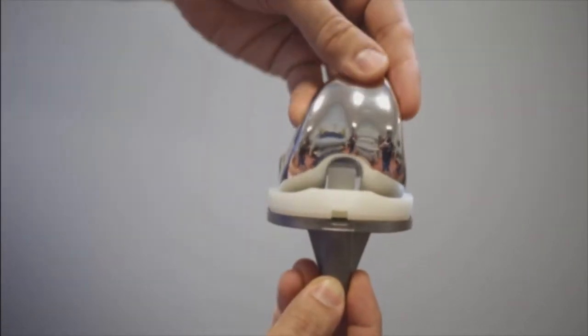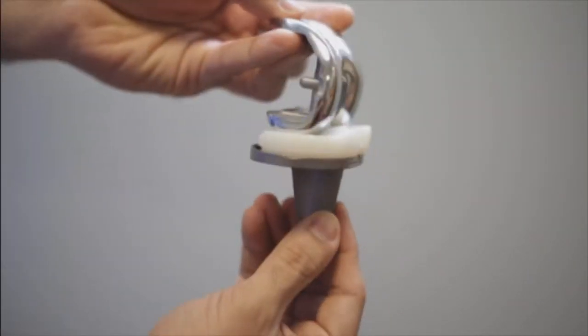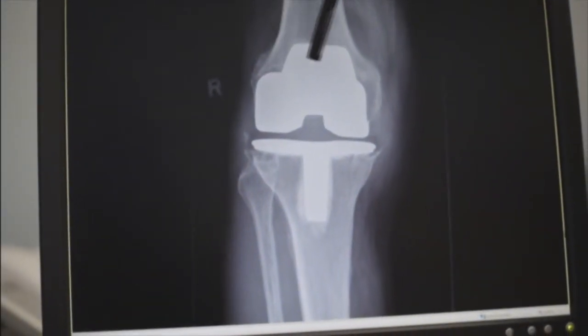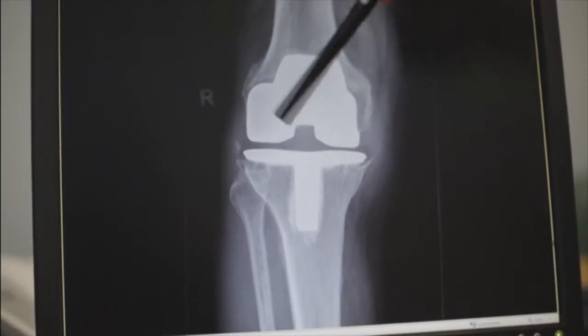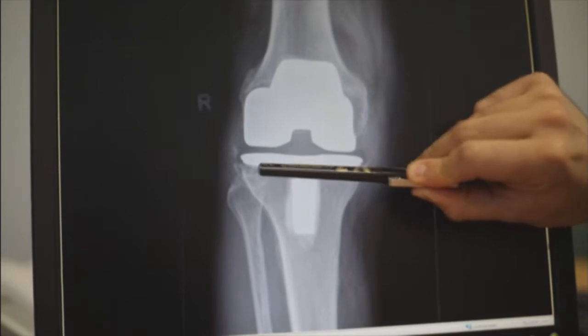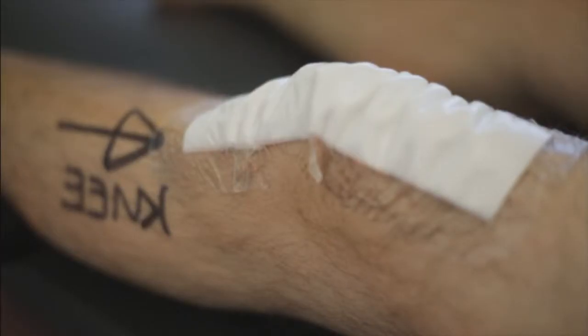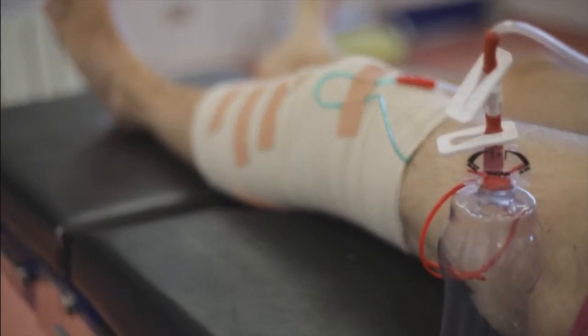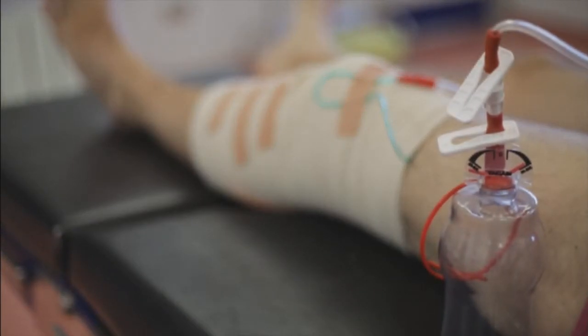Between the metallic components, a 1 centimeter thick, hard-wearing plastic is inserted to take the place of the shock-absorbing cartilage that is removed as part of your operation. These components are initially checked for fit before they are cemented into place. The different layers of your knee are then stitched together, and the skin is closed with either metallic clips or dissolvable stitches, depending on your surgeon's preference.